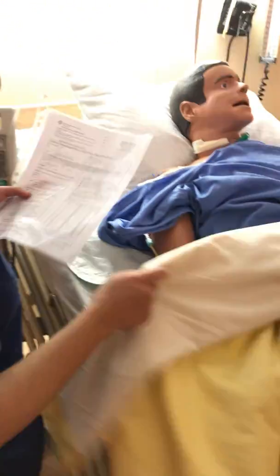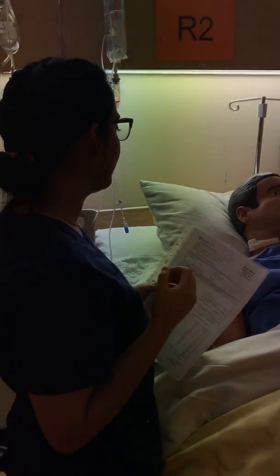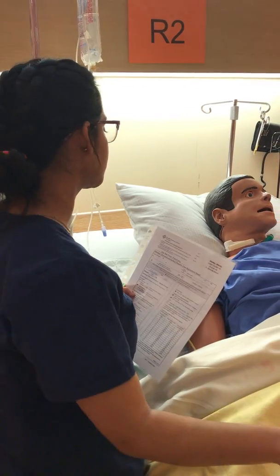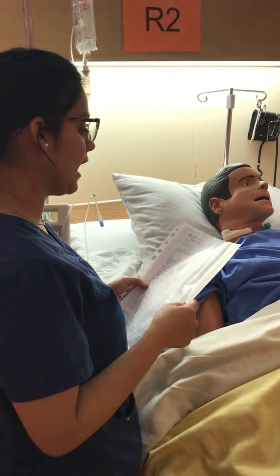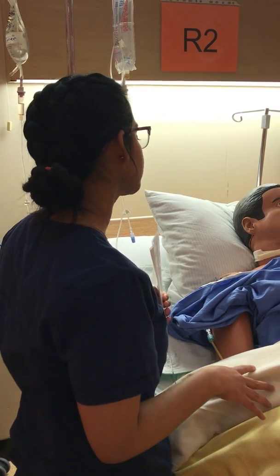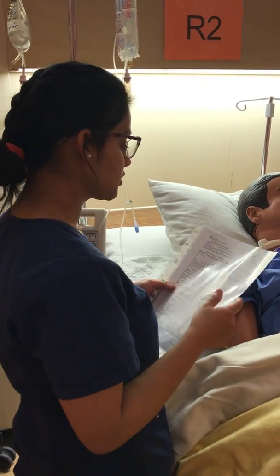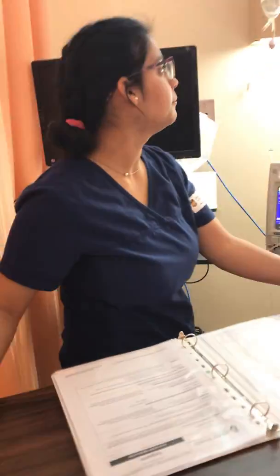Wendy, today we'll be giving you heparin because we want to prevent any clots from forming, since you have DVT. And later on, I'm also going to be doing your chest tube dressing change because it is due for change today. At this point, the patient has the right to refuse, but they're not, so we're going to move on.